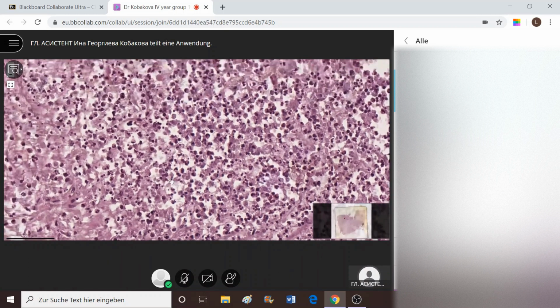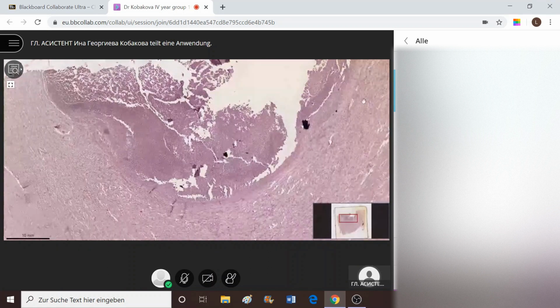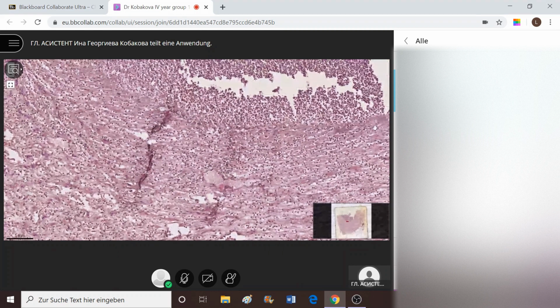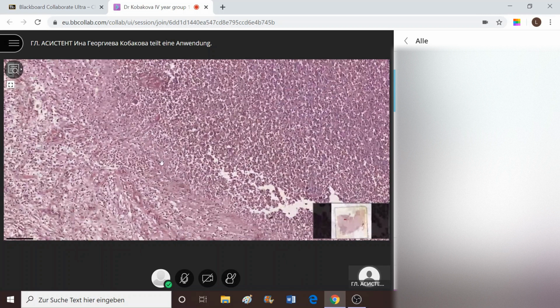So pretty much this is the abscess cavity in here. And this is the demarcative membrane around the abscess. Now, should we expect fibrous tissue to be around the abscess? We see some beginning of formation. That's when the blood-brain barrier lets fibroblasts go and eventually migrate through it, reach the brain, and form something like a pyogenic membrane of the abscess.